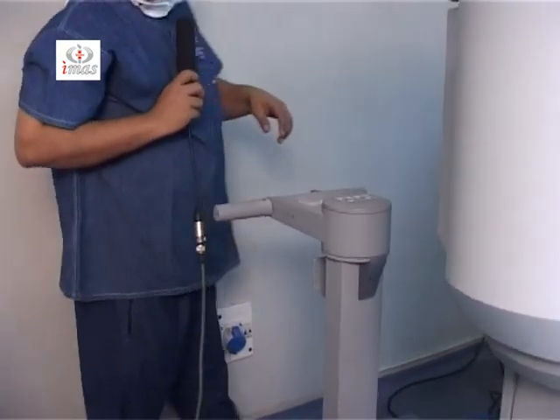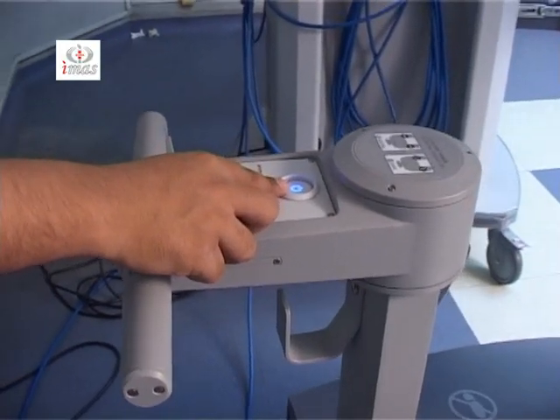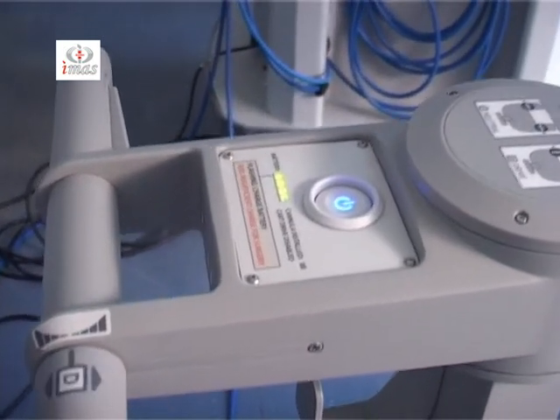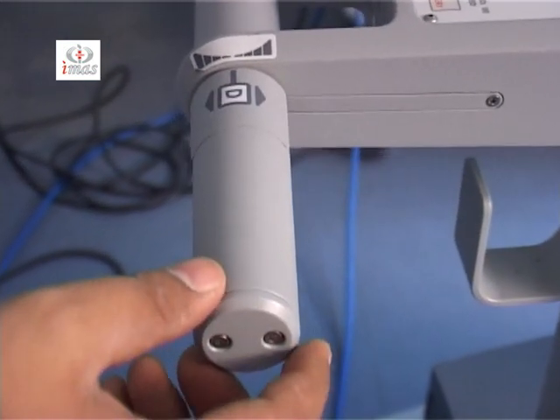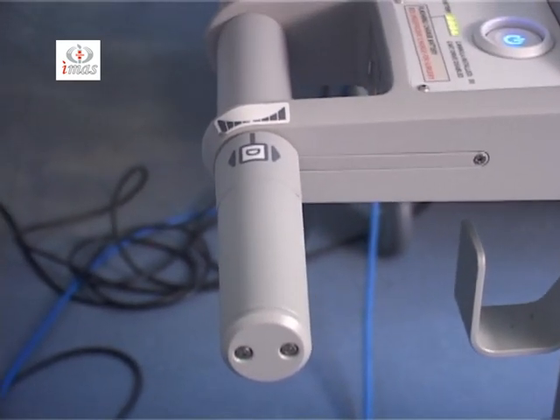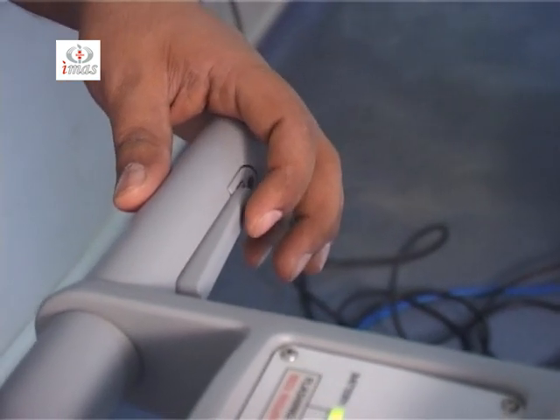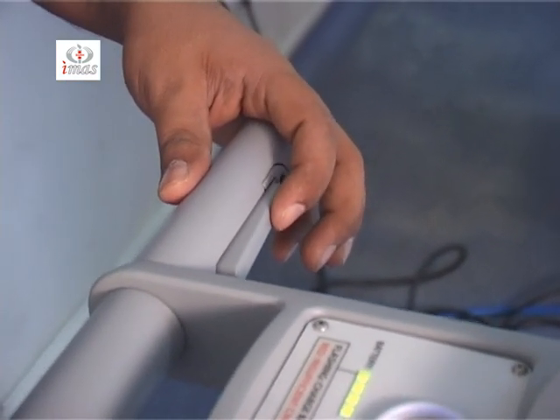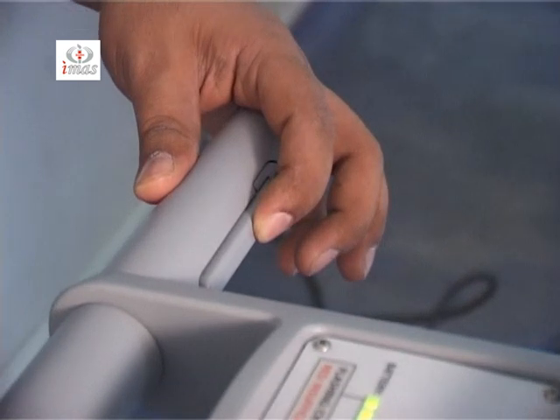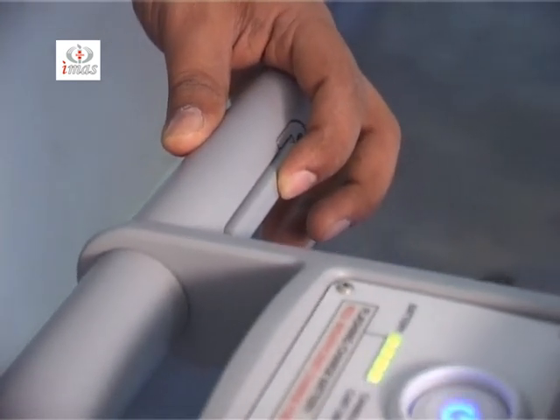So you can see here, this is the power switch for the patient cart. This is the throttle, which can be throttled anteriorly or posteriorly, and this is the throttle enable switch, which has to be pressed in order to move the patient cart. So if you want to move it, you just have to press the throttle enable switch and press the throttle, like I'll show you.